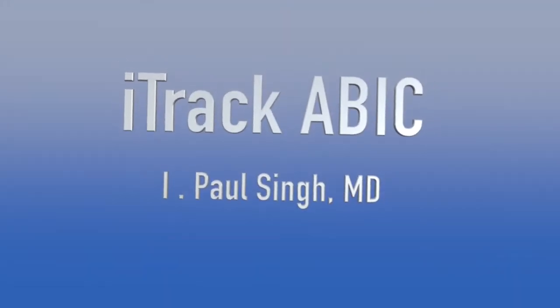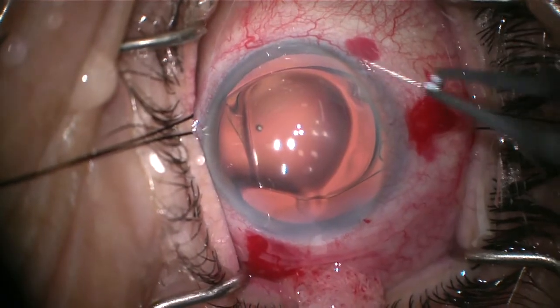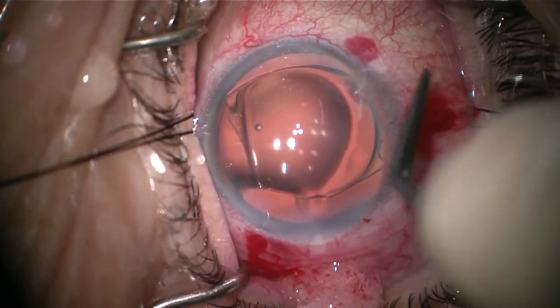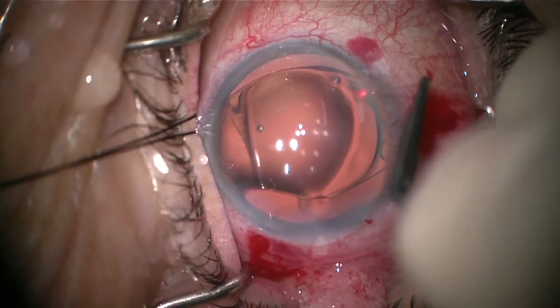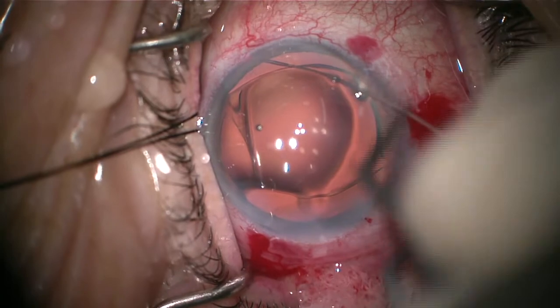Dr. Paul Sain describing a case of i-Track ab-interno canaloplasty, or ABIC. Here we are after the cataract removal and lens implant into the capsular bag, viscoelastic in the anterior chamber and on the cornea, as well as the paracentesis already made at the 11 o'clock position, placing the i-Track catheter into the anterior chamber.